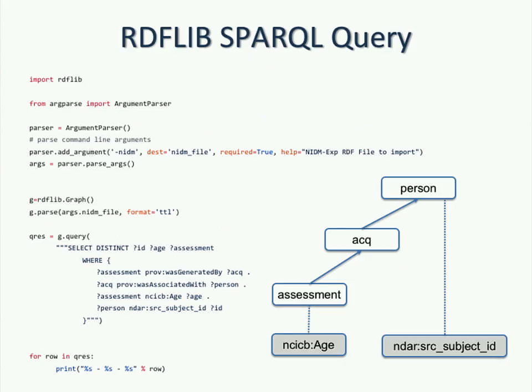I don't know, Dave, when that's on the roadmap, but I think some of these simpler queries are one of the goals of PyNIDM at some point, so you don't actually have to issue direct SPARQL queries. But these are things that are in development, and I just wanted to highlight them here.